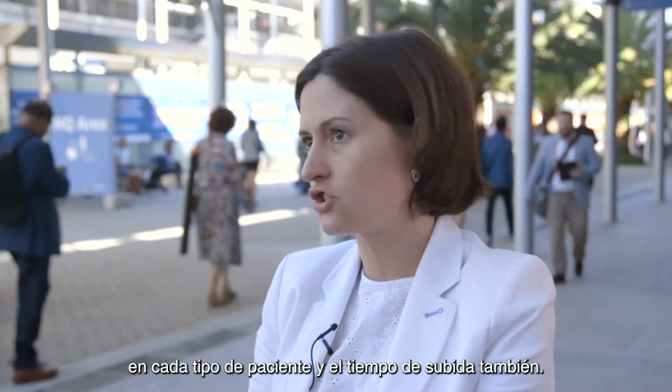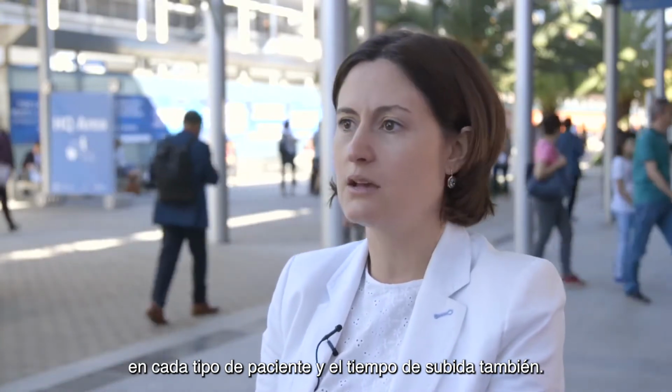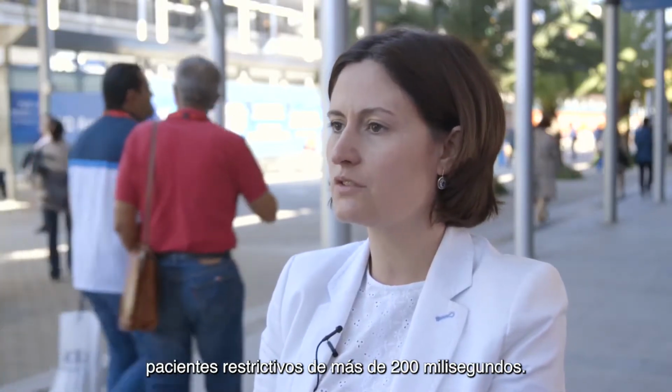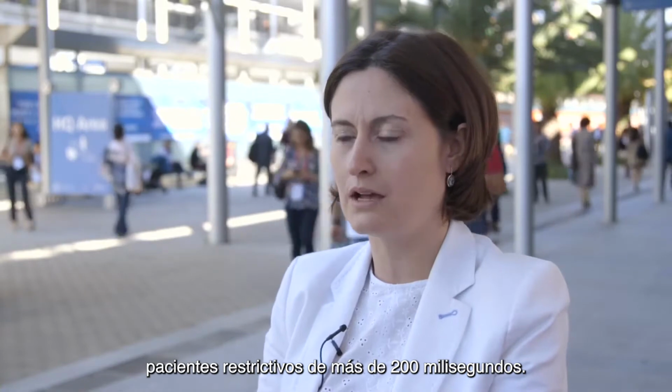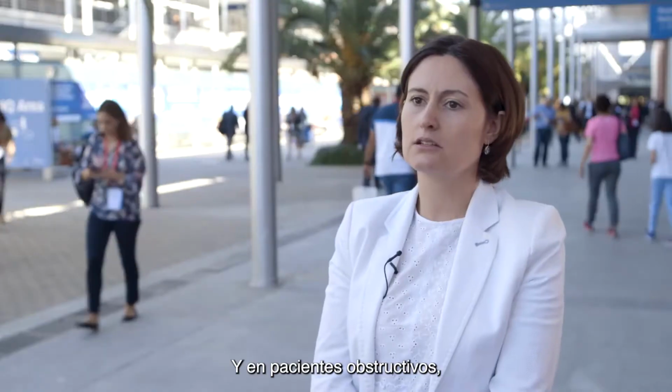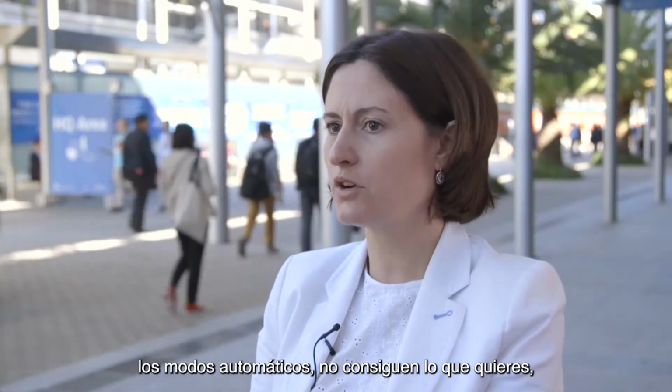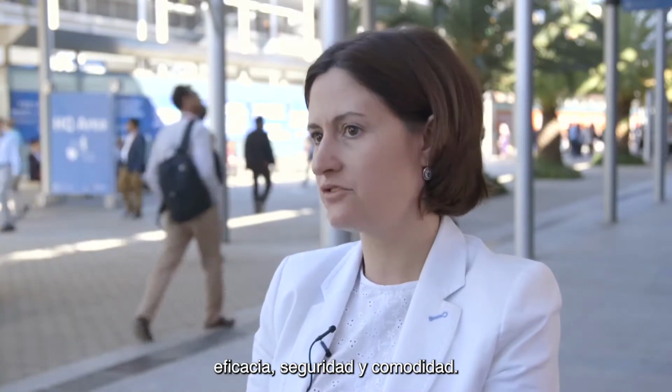The triggers must be titrated in each kind of patient, and you must choose the rise time too: in restrictive patients, more than 200 milliseconds, and in obstructive patients, 150 or 200 milliseconds. So this must be very well titrated, because if you don't do that, this kind of automatic mode doesn't achieve what you want: the efficacy, the safety, and the comfort.